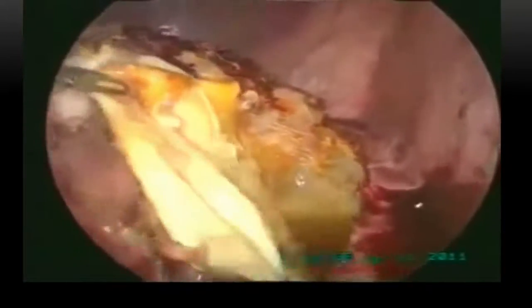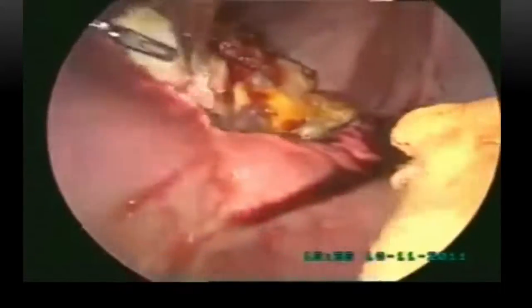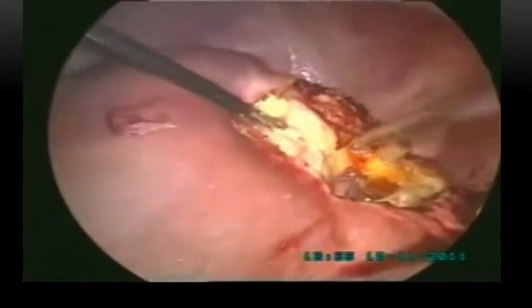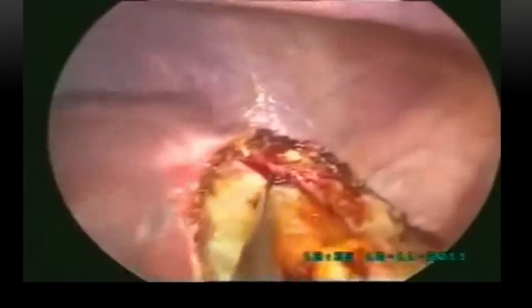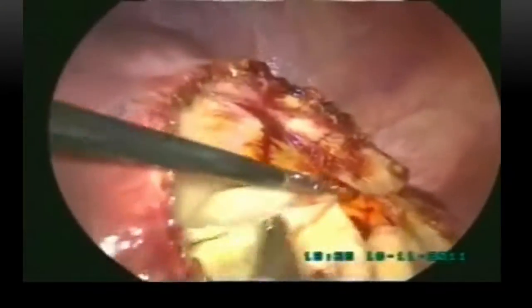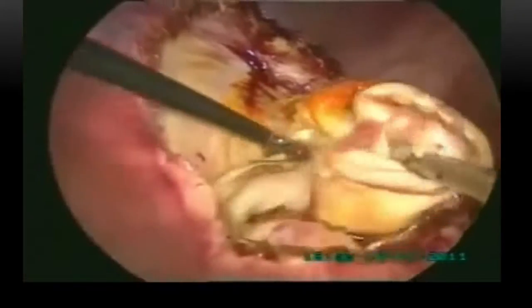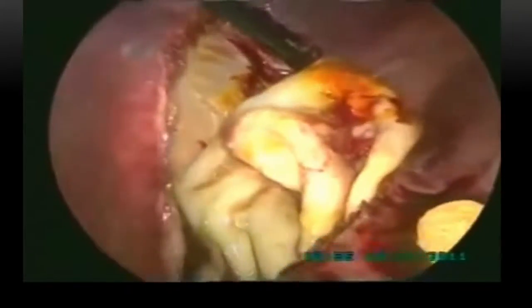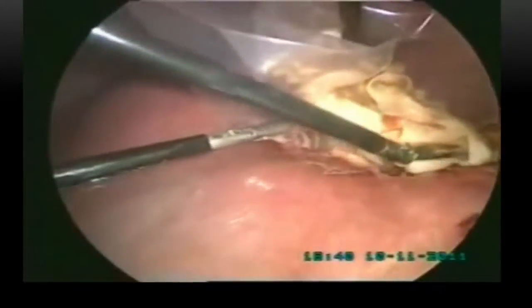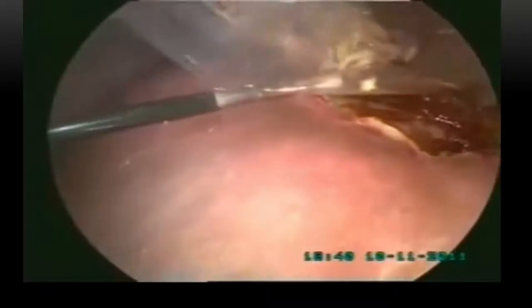Yes, sometimes germinal layers are broken. Like here you can see, it won't come, especially if it is an infected cyst. Then with a gauze piece, you have to rub to take all those layers out. So de-roofing is required, otherwise, it is not necessary to complete de-roofing. A little bit of opening is required to pull the germinal layer out without breaking it. And in the endo bag, you can put all the germinal layers.